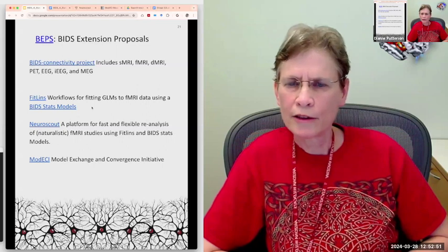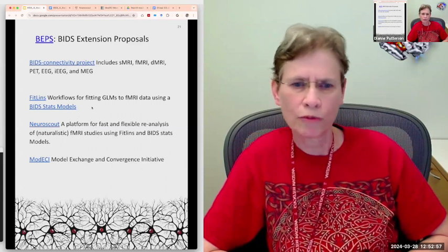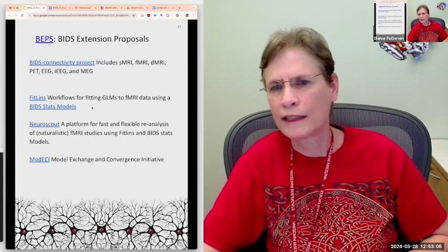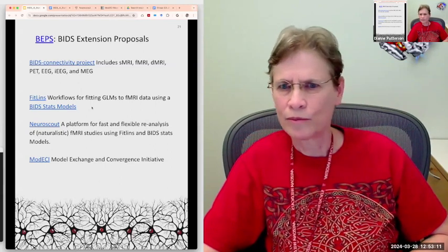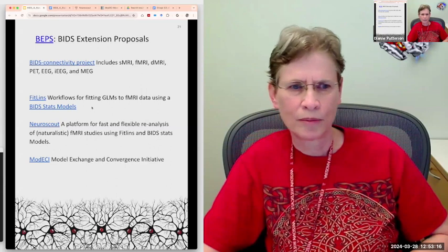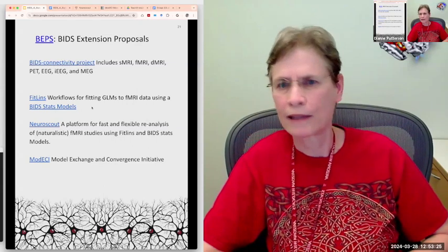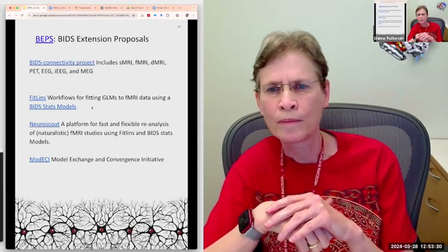So definitely go and read that Poldrack 2023 preprint paper, because a lot of what he focuses on is how did we get started with this? Where did we make mistakes? Why did it work for neuroimaging? We did have a lot of different image formats early on in neuroimaging, but the NIfTI format was the first attempt at really standardizing, and that has had an important impact. Not that the other formats don't still exist, but NIfTI kind of rules the roost.